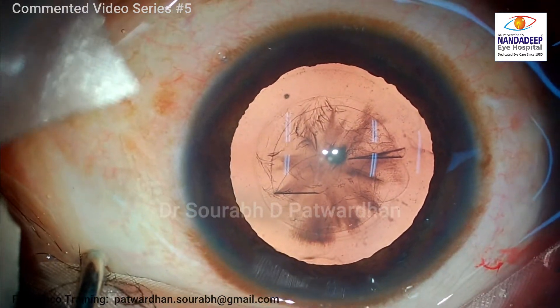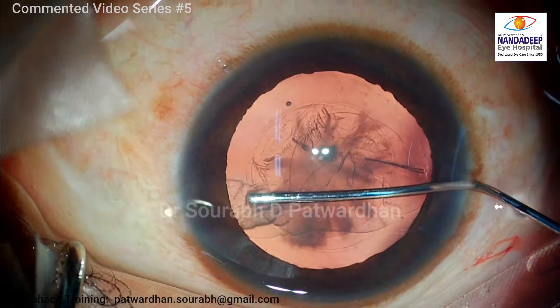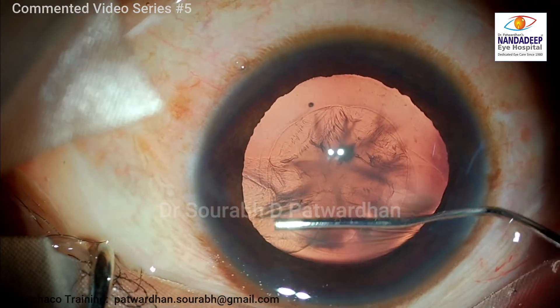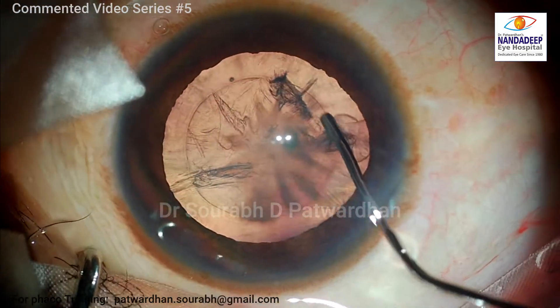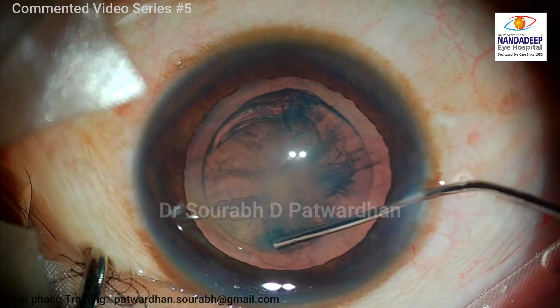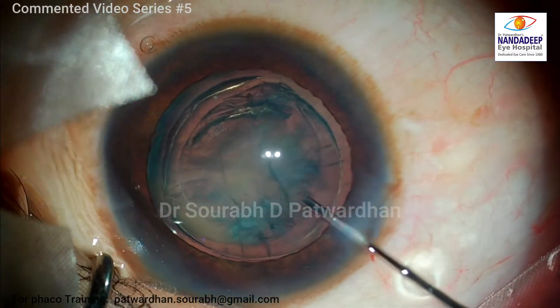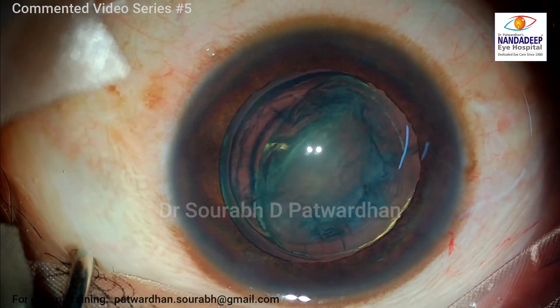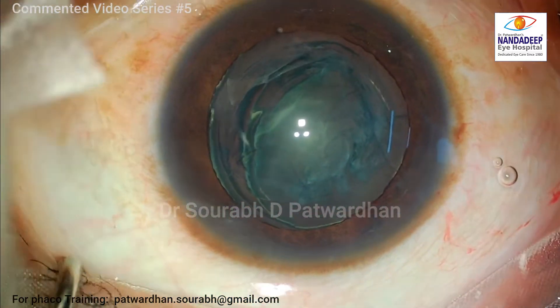The CCC was done under 2% HPMC. For younger eyes I would recommend beginners to use better viscoelastics like 1.4% or 1.8% hyaluronate, or use Viscoat, which gives much better control over the capsulorhexis. If you are using a cystitome, use the side port for small incision to have a safer and more complete capsulorhexis. For softer grade cataracts I always do hydrodissection first, then multiple hydrodelineations — as you can see here, you can see the multiple golden rings.